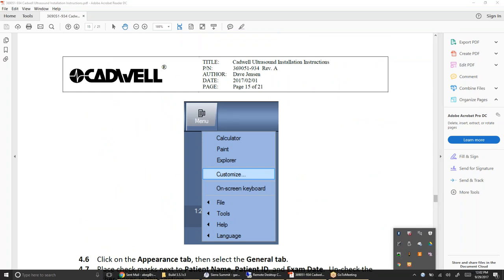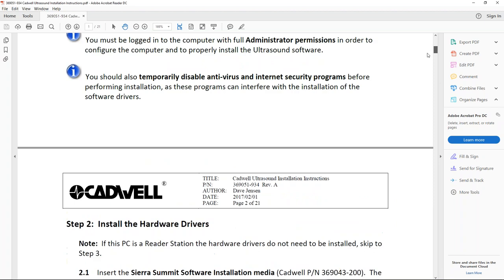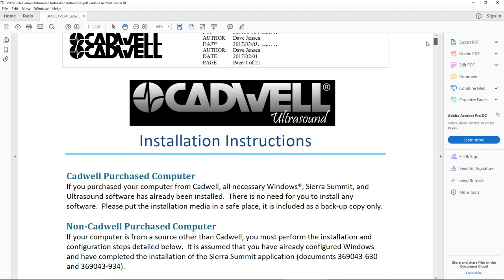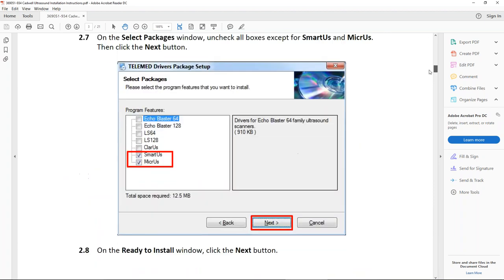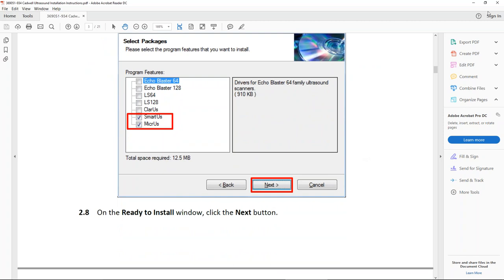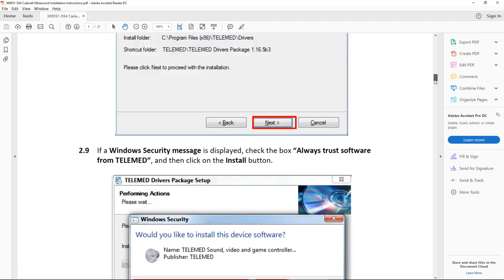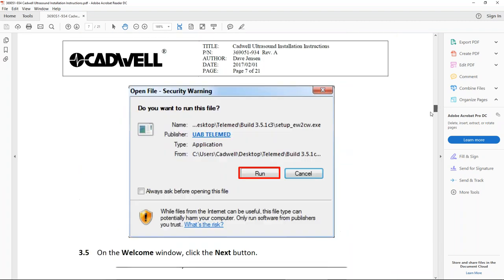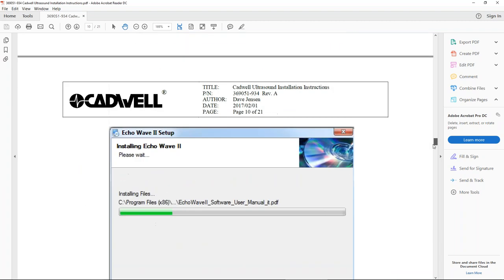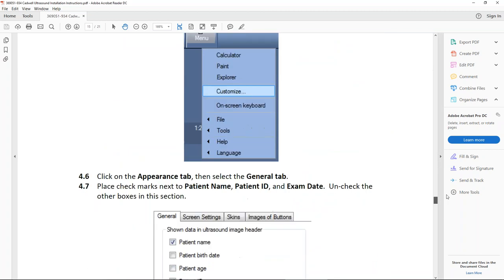When you install it, you'll actually get a screen. So pretty basic — you'll come in and get this screen here, and you'll just want to uncheck everything but the SmartUs and MicrUs. The only other thing I wanted to note — the instructions are pretty self-explanatory, it's pretty easy to install.